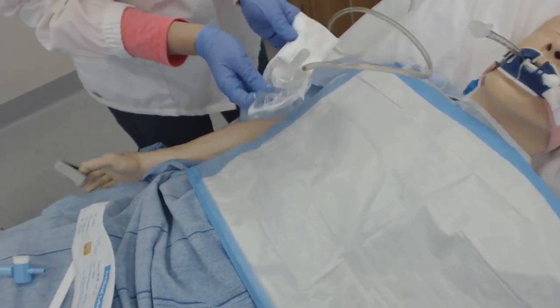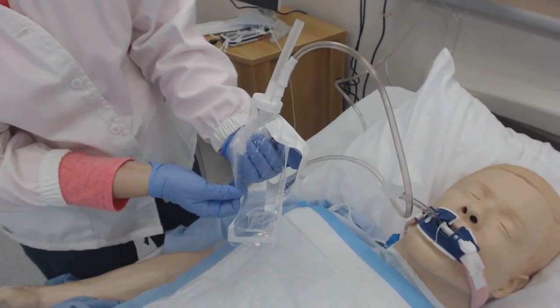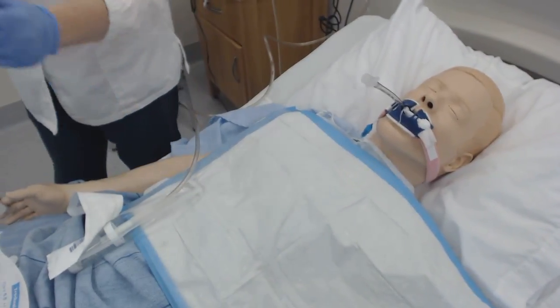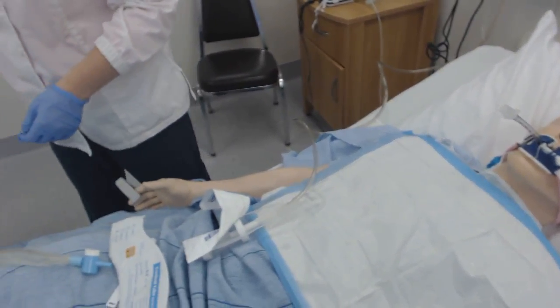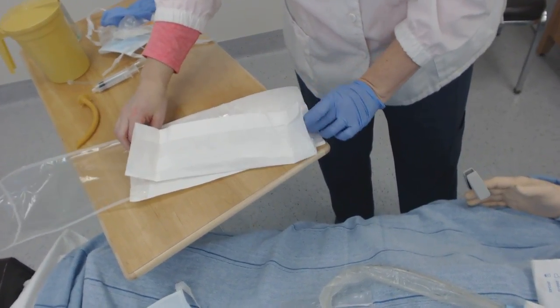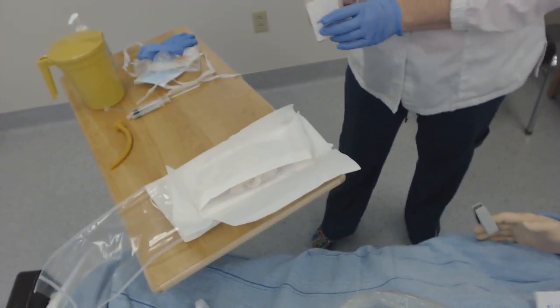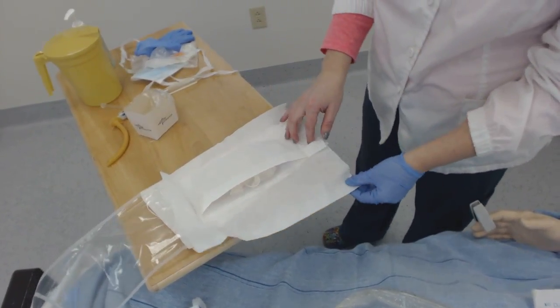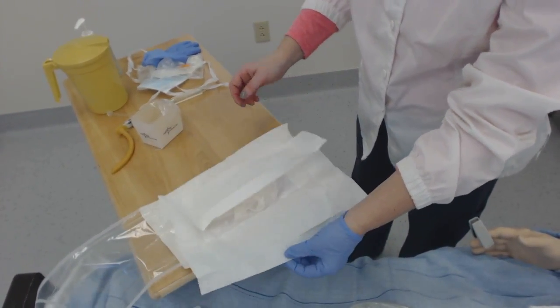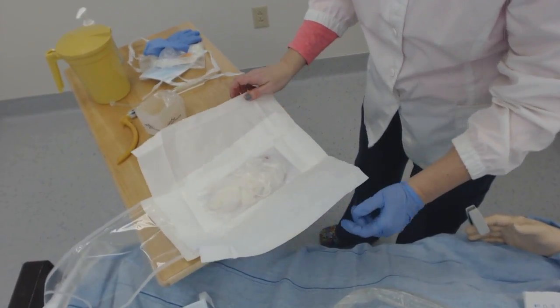Do you see how this is? This is just like a trap in the sink.